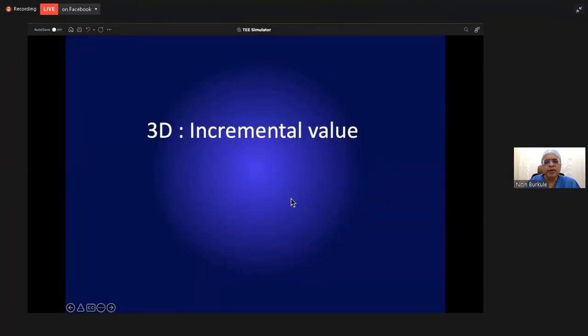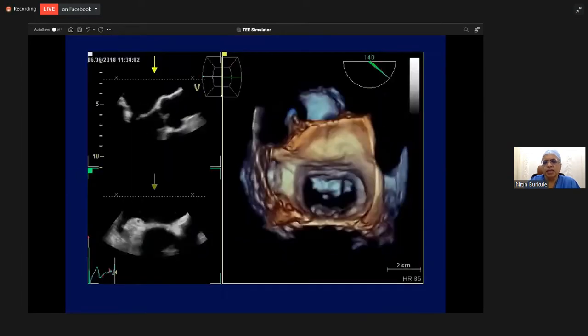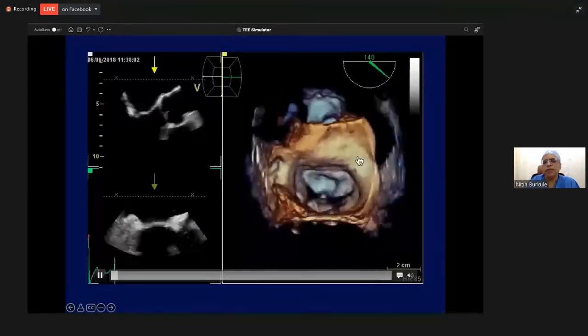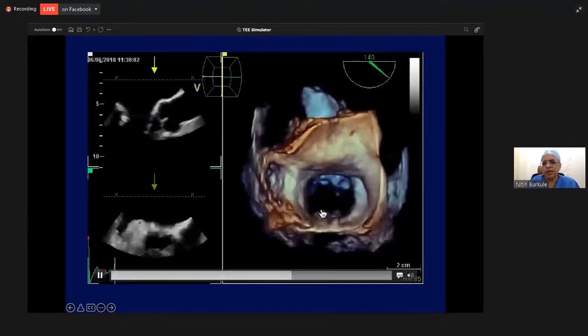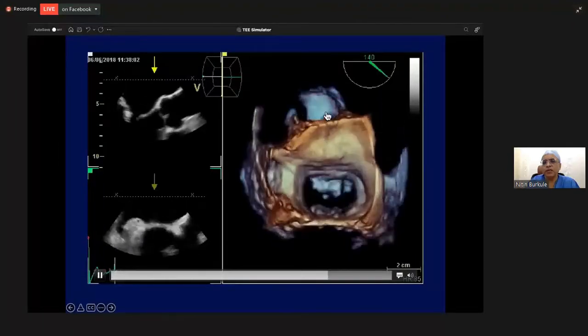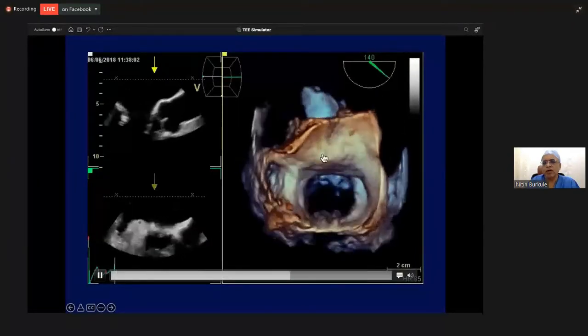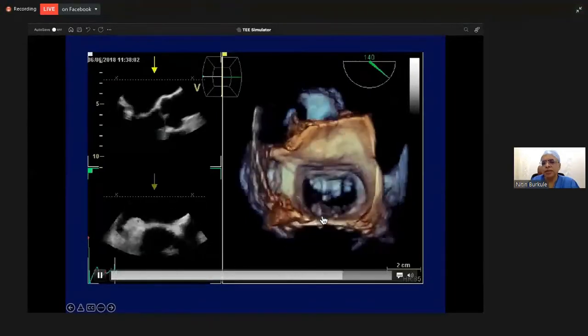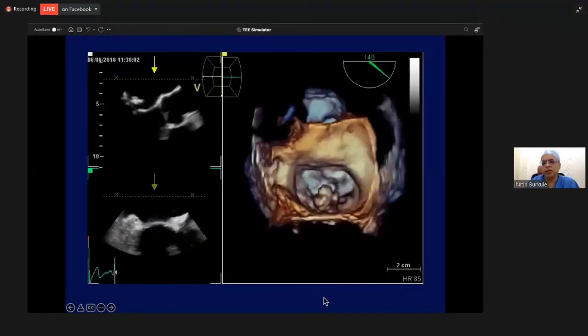The 3D, when you turn it on and acquire a data set, gives you an incremental value, and you get these kinds of pictures, which the surgeons love because that is how they think of the mitral valve. So this is the LA appendage. This is the position of the left ventricle outflow tract and AML. This is the lateral commissure, medial commissure. And you can see the PML has a P2, which is flail.